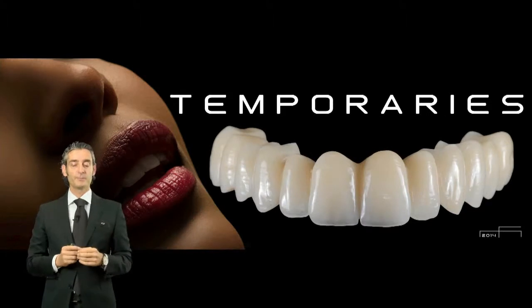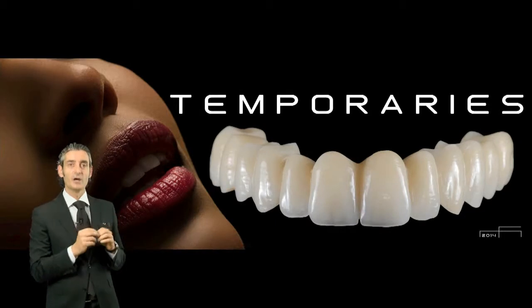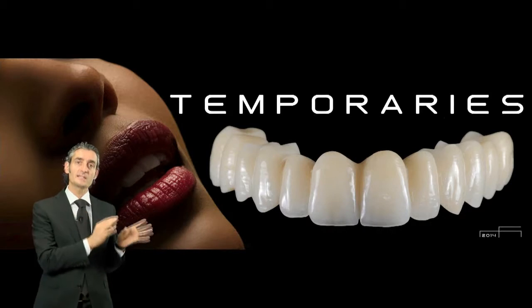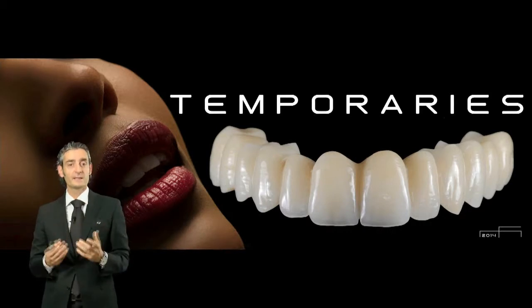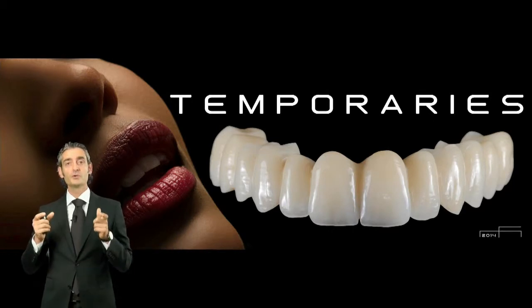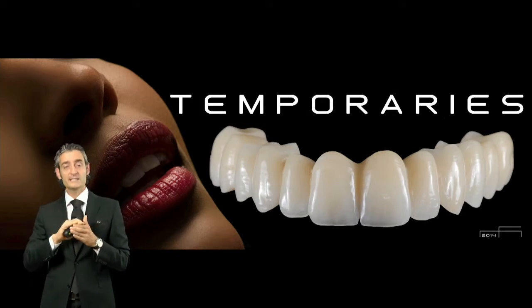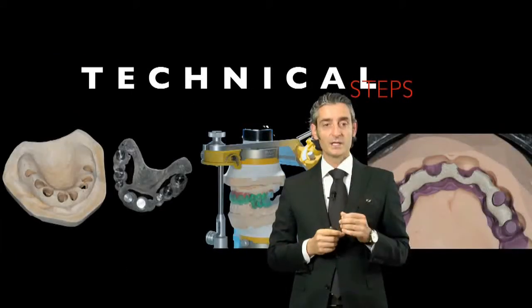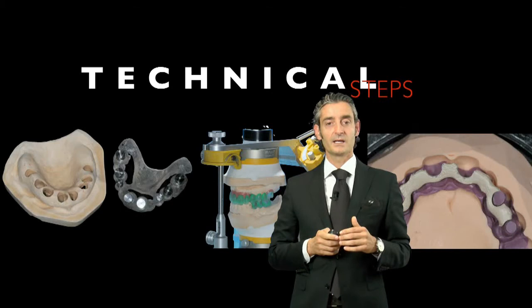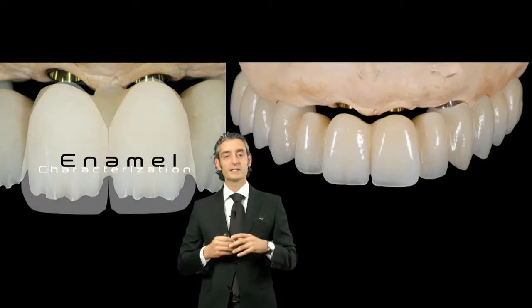Before starting with the surgery, what we want to have is a temporary restoration that fits exactly our request and our aesthetic analysis, which we tested in the mouth before, so a copy of our radiographic stent. And for sure, what we want in this case is really good primary stability in the posterior implants, just to have the space to create this vertical augmentation, placing a PTFE membrane in the front. We create this provisional restoration with a framework inside to make it stronger, and we create special effects in the incisal area to make it much more natural.